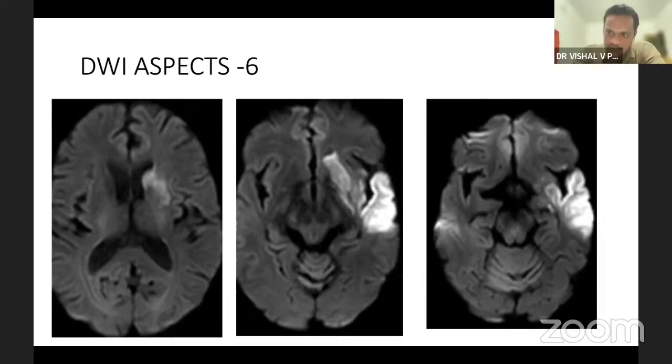Chronic stenotic process got occluded now. How do we know? Because a thromboembolism happened. Okay, that is one way. We are theorizing that. So there has to be a forward flow, otherwise it will not have carried out. Why would it come all the way across the anterior communicating artery and go that side, with no evidence of infarction on the right hemisphere, posterior? You don't know. So agreed, that is one point. Is there any other evidence that you can use to say that this is a chronic stenosis that has got occluded now?